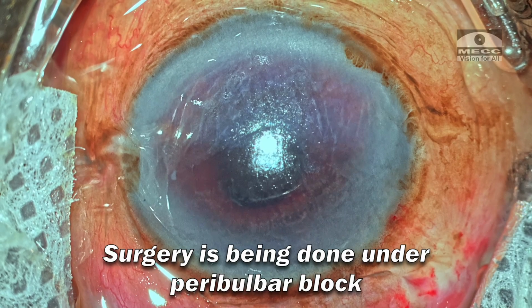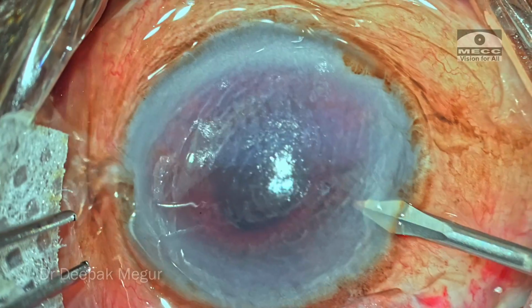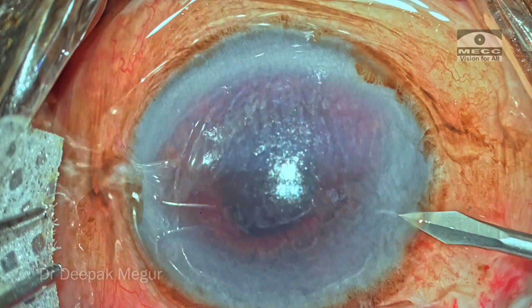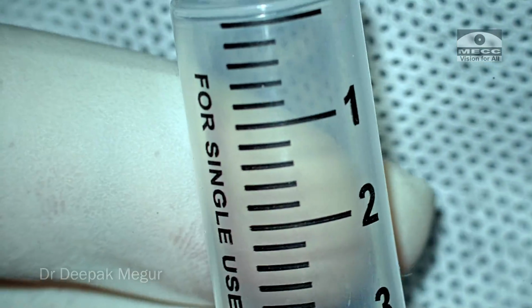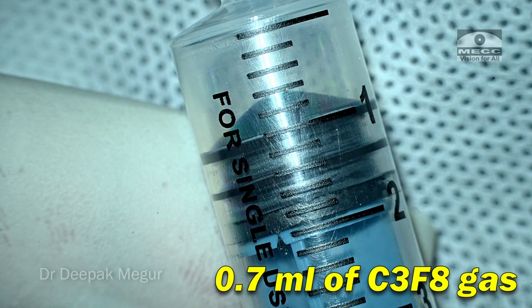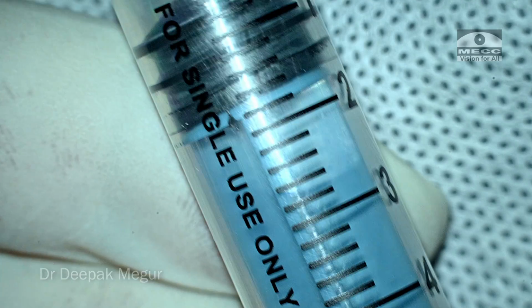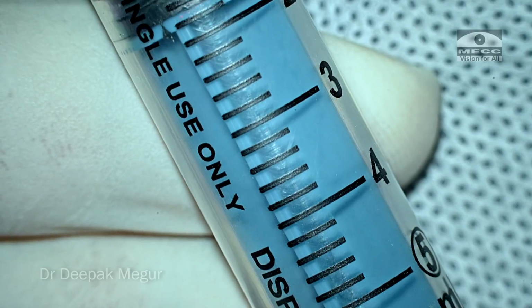So the surgery is now being done under peribulbar block. Speculum is placed. I am making a separate fresh side port entry. For mixing the gas to the desired concentration, we're taking 0.7 ml of C3F8 gas and mixing it with air to get the total content in the syringe to 5 ml.